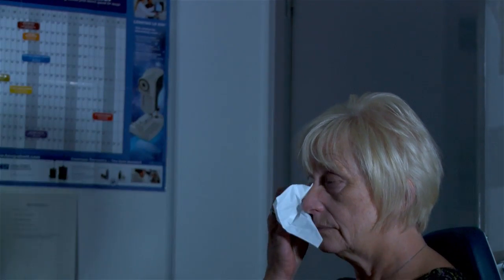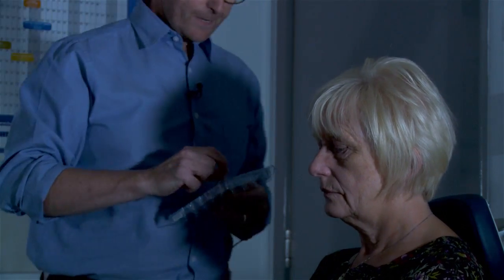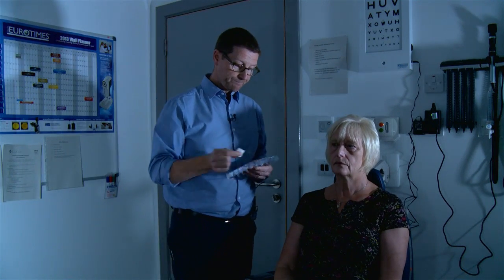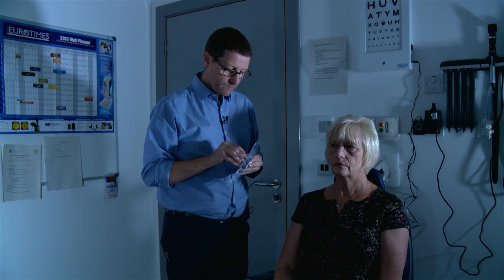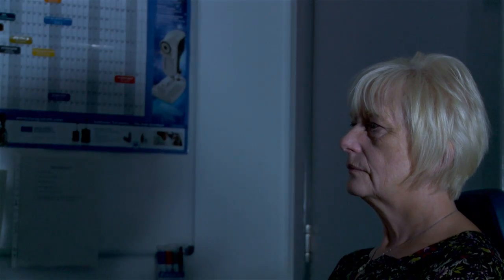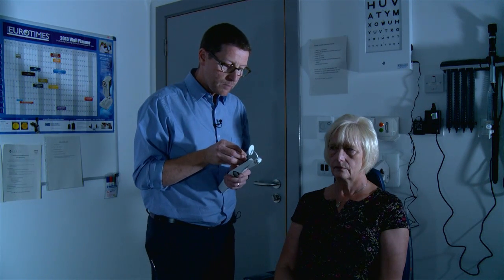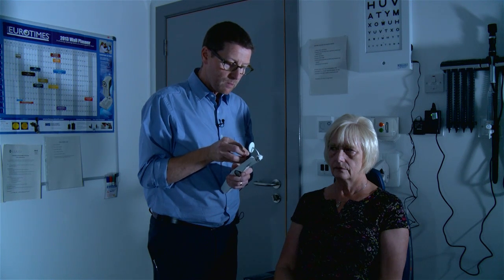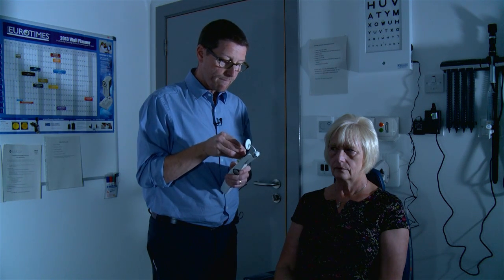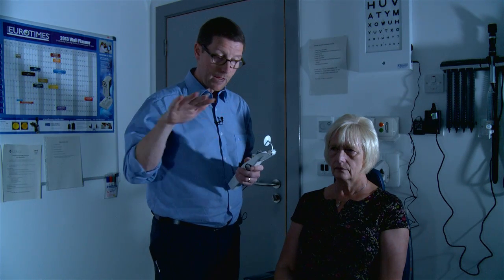Disposable prism heads again — get it into position. Just the same as the big one, we're going to insert the prism head into the holder, making sure that the wee flat bit is at the top so it's sitting nice and flat along the horizontal.